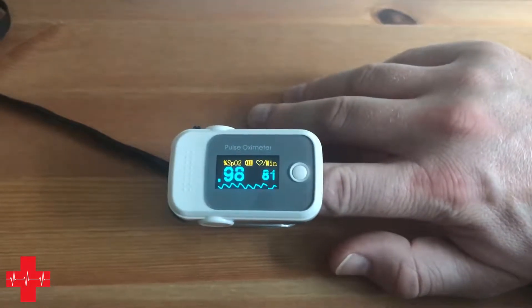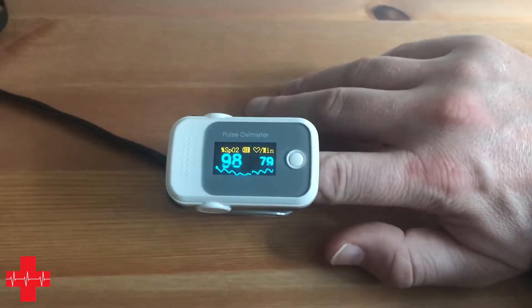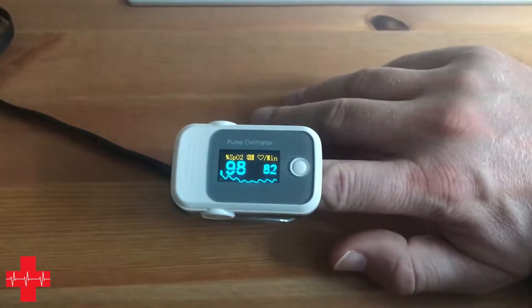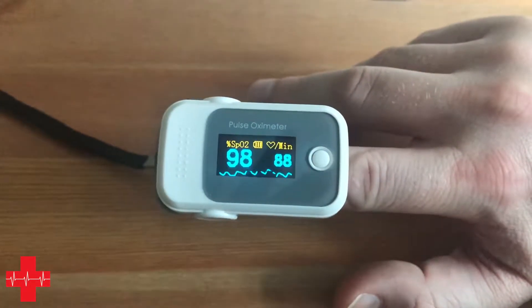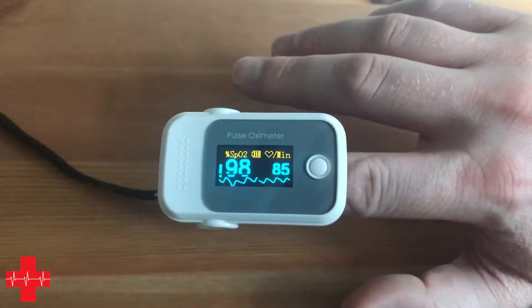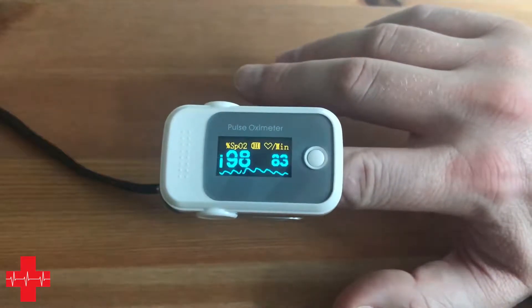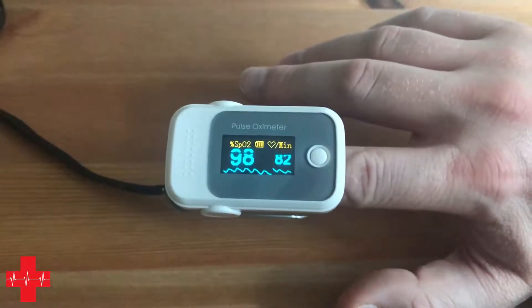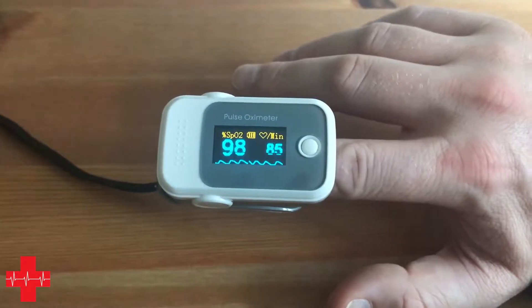When using a pulse oximetry device there are of course a few challenges. Challenges vary a little bit between device types. This is a fingertip pulse oximeter — using one of these is more of a budget range. On the entry level or fairly affordable pulse oximeters the challenge is that the technology being used is not quite as advanced as in the more expensive pulse oximeters.